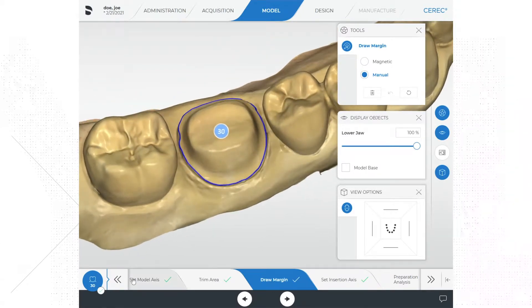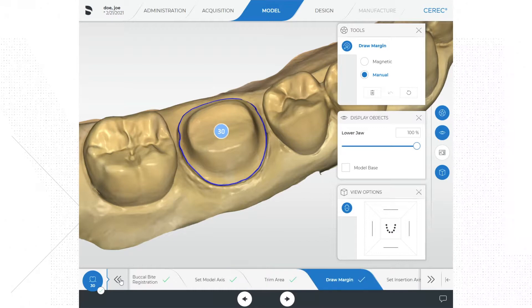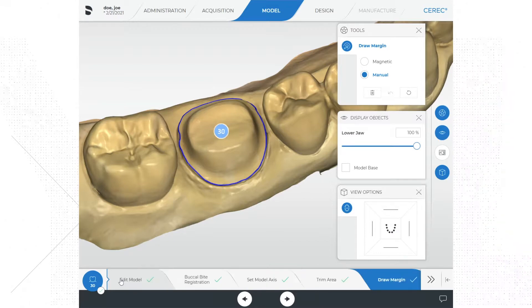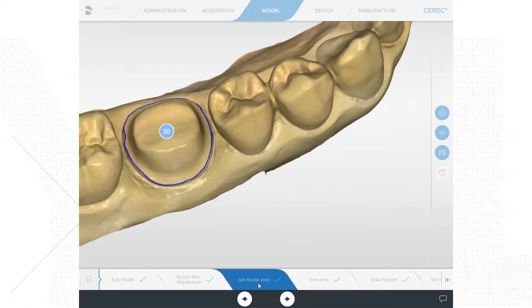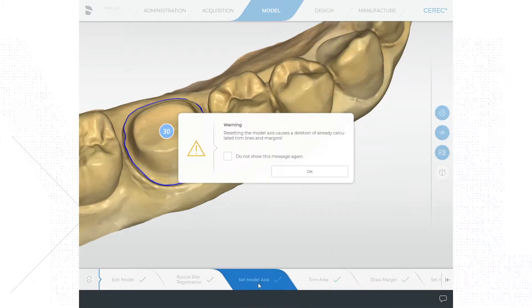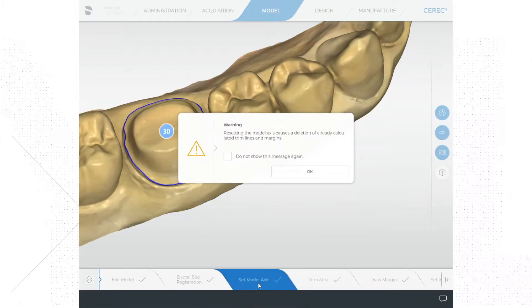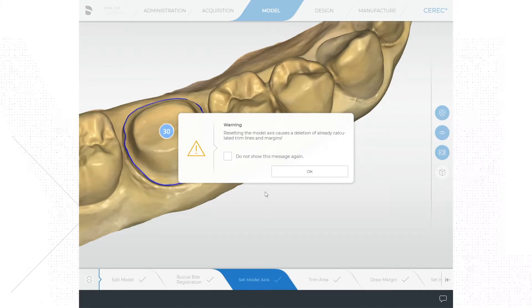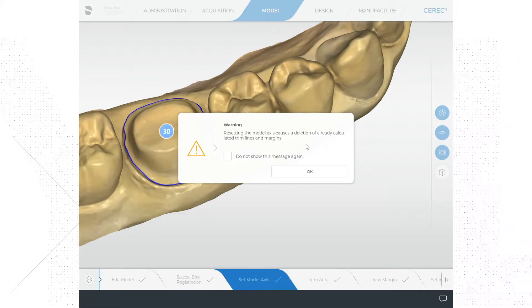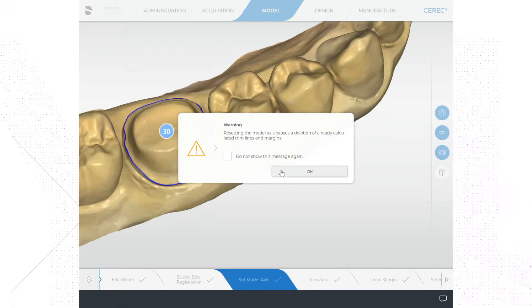Despite the software automatically doing this for us, we are going to go back a couple of steps and check those steps and make any necessary adjustments as needed. First I will check the model axis. On the bottom step bar, find the model axis and click on it to activate that step.